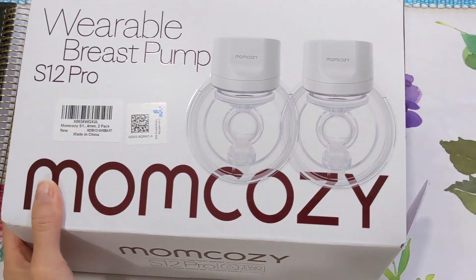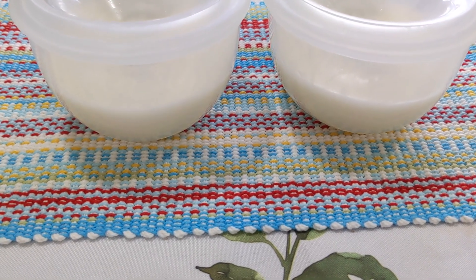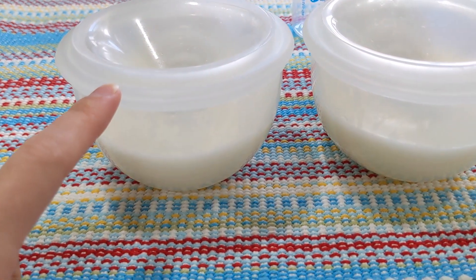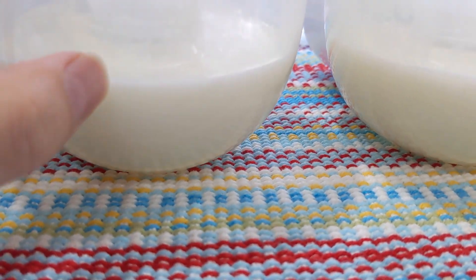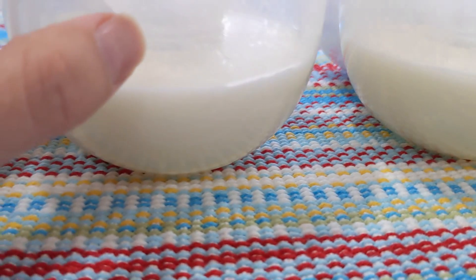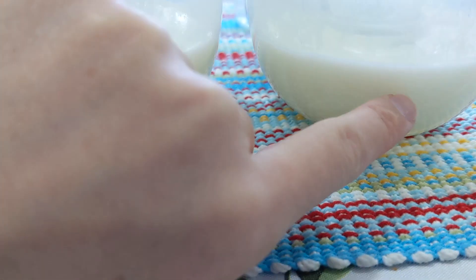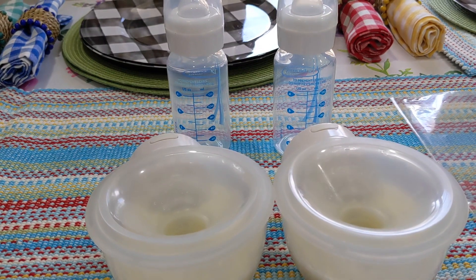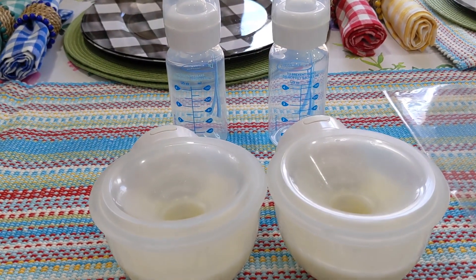I pumped for 30 minutes — most breast pumps automatically shut off after 30 minutes. This is what I got out of my left breast, and this is the right. You can see there's a mark — this shows 120ml and this is 180ml, though it's hard to see. I'm going to empty those into a bottle so you can see how much milk I got out in 30 minutes.